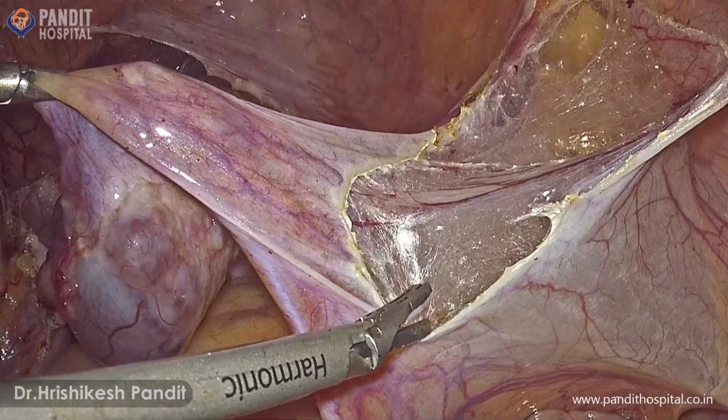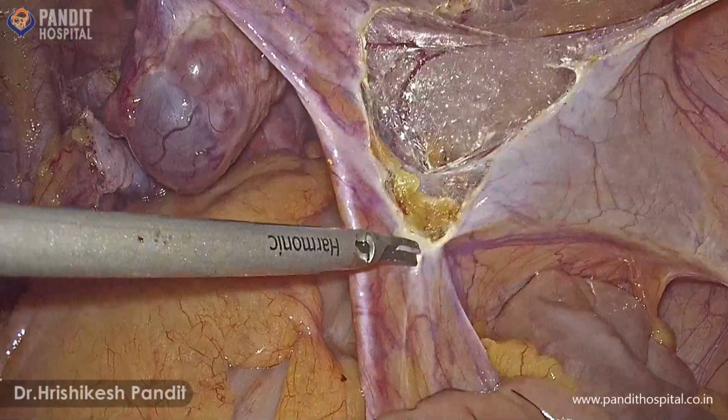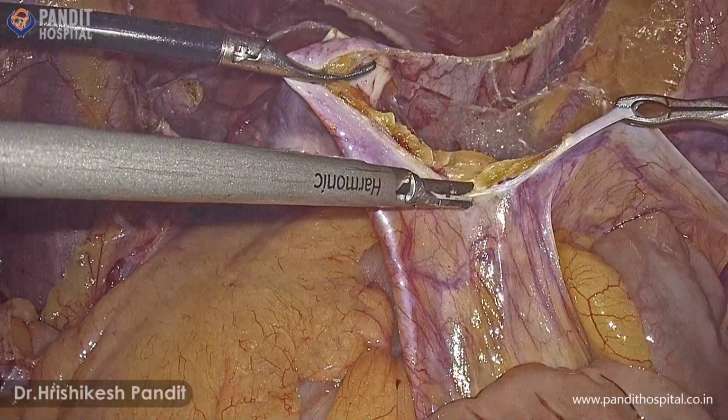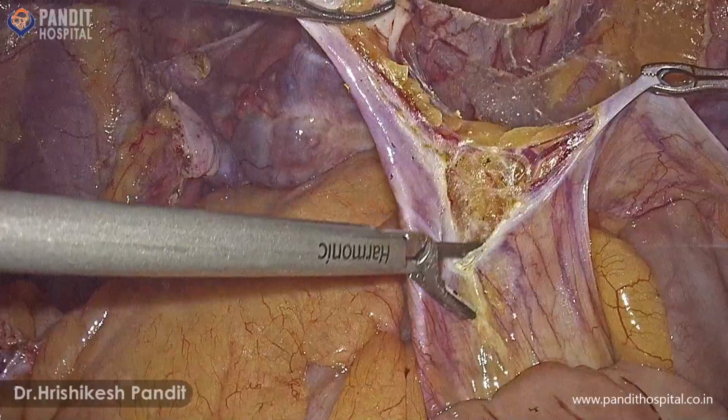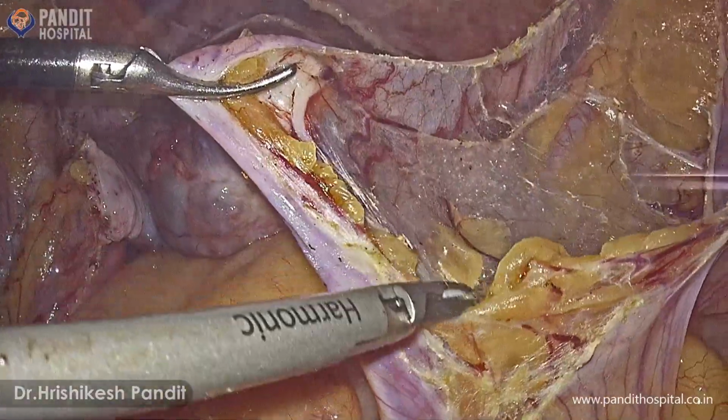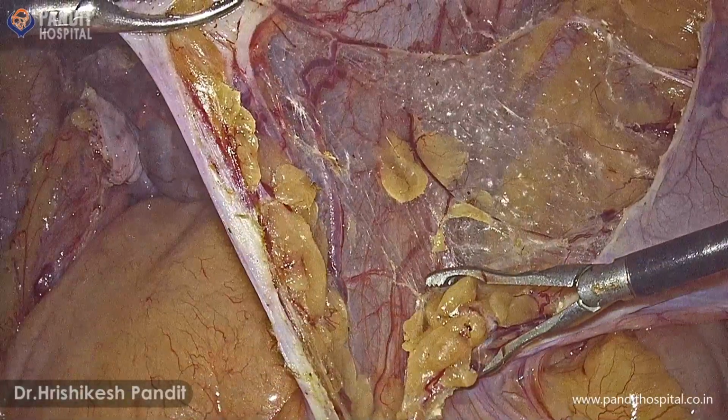Important is to note that while doing this, the surgeon shifts the traction of left hand from round ligament to IP ligament. Incision is continued till the sacral promontory.